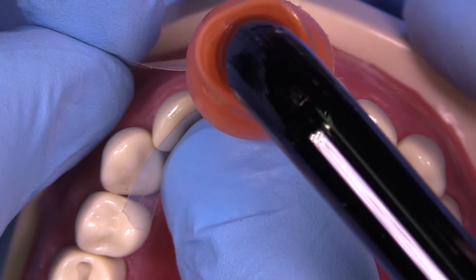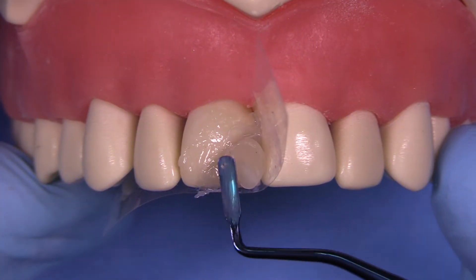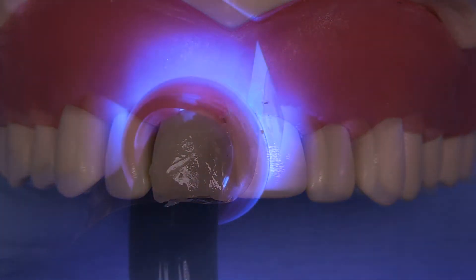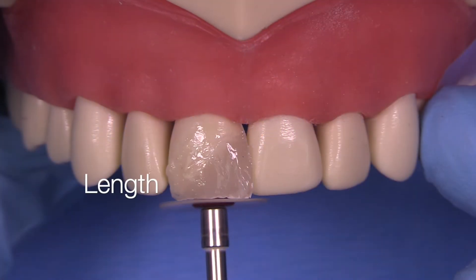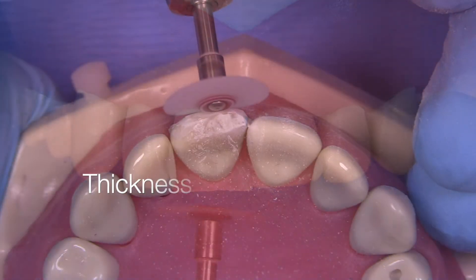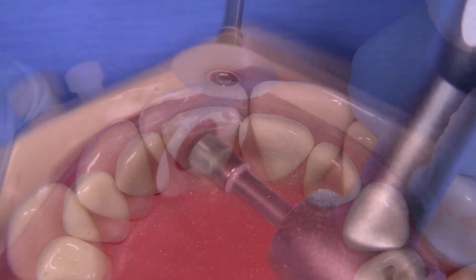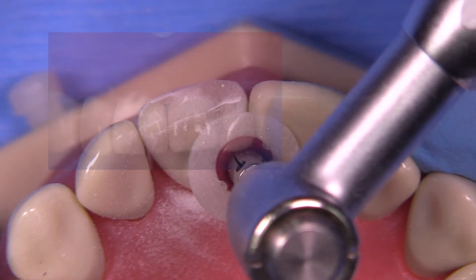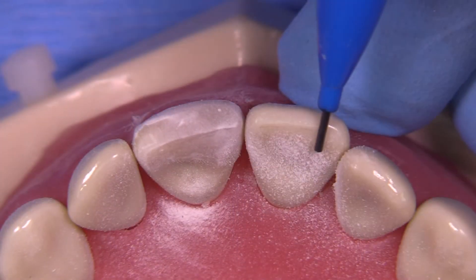Curve the matrix around a little bit, light cure through that, and then add a little bit more composite if you need to, to over-contour it on purpose. And then we're going to do length, thickness, line angles, and then micro-anatomy. That's the approach that we want to do before we start the polishing phase.